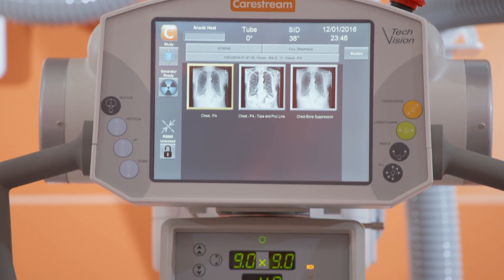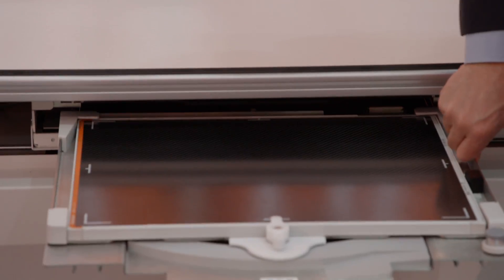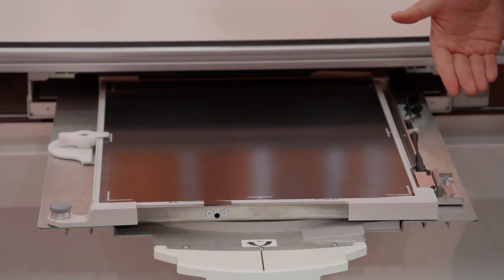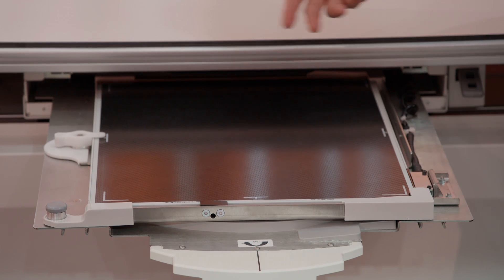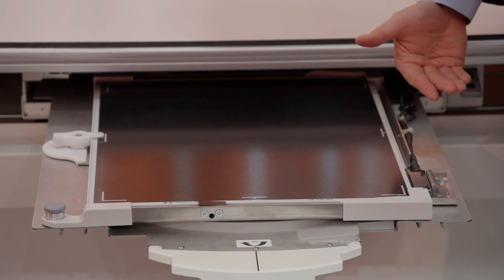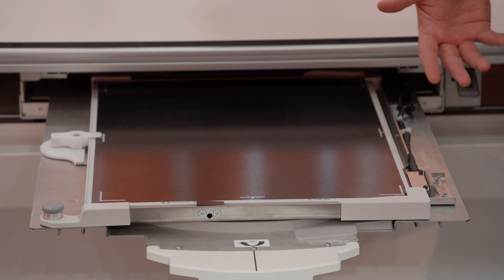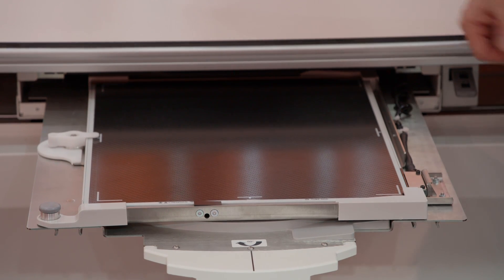Going to the bucky tray, the tray has the capability to have a rotating option for the 35x43 size detector. We also have this in an intermix bucky, which allows you to swap out the 43x43 detector or the 35x43. And we have a full selection of analog bucky trays that are the traditional style.